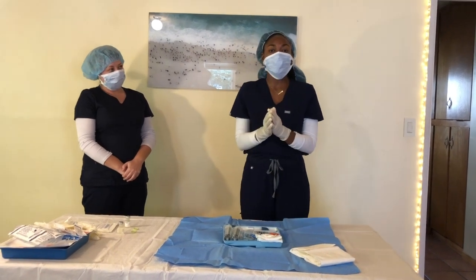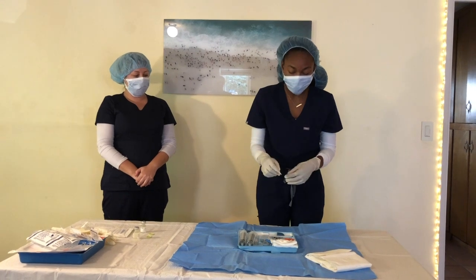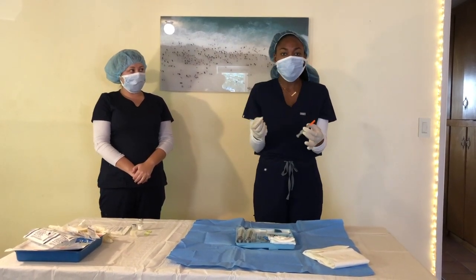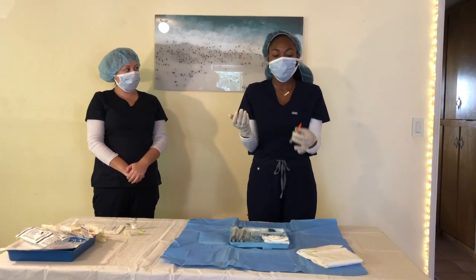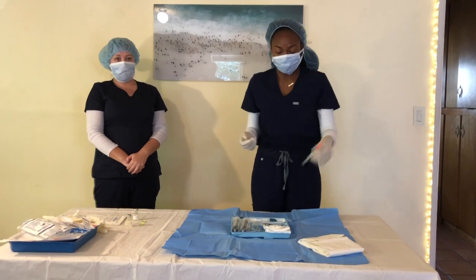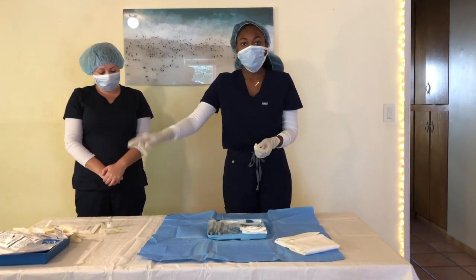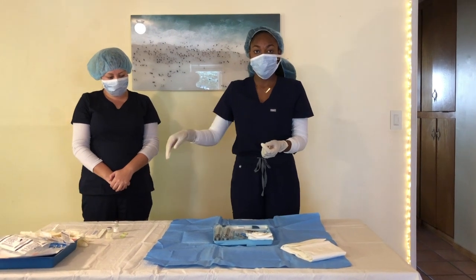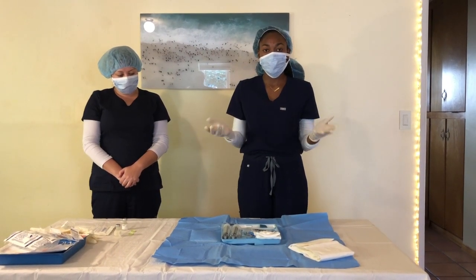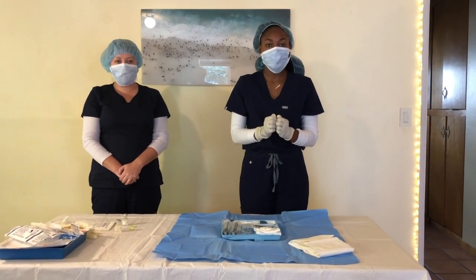We're gonna put this right here. So if the doctor uses this, the procedure is done, we would always wanna put this just like this. You don't take off the needle. That's dangerous, and at that point it's a dirty needle. And dispose it in a red sharps container. Also, all of these things are one-time use, so we'd wanna make sure we throw them away in the proper container for pharmaceutical drugs and things like that. Always dispose properly and safely.